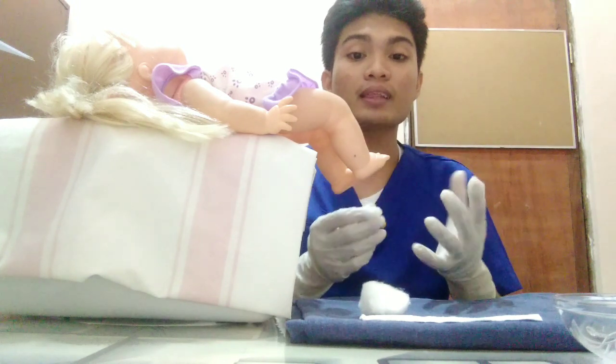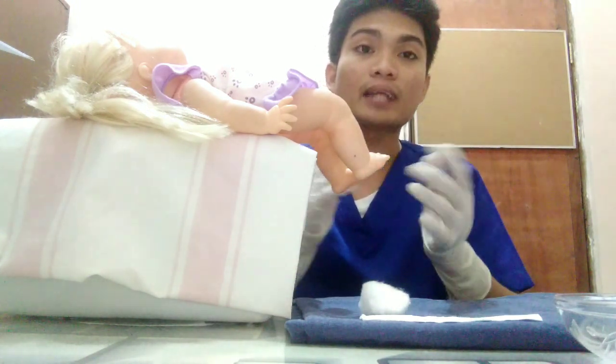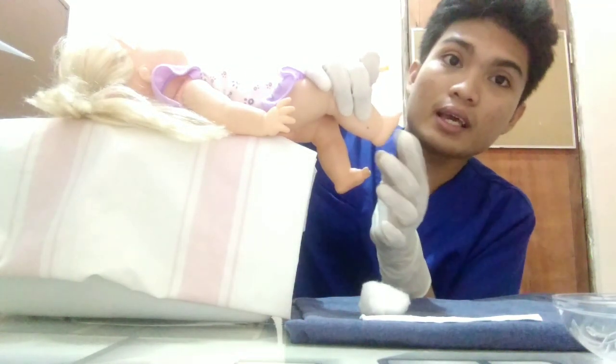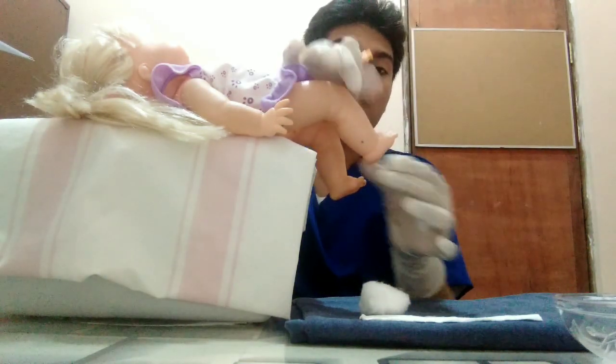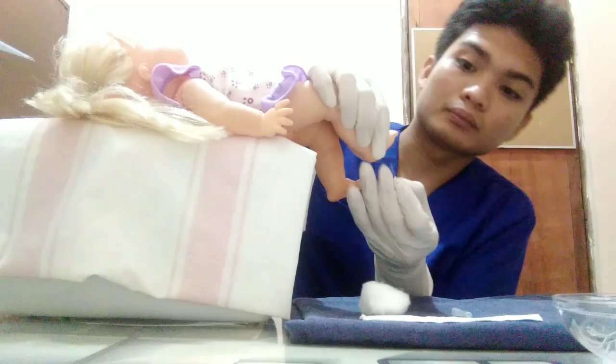So when we prick the heel of the baby, we should prick on the medial side or the lateral side of the heel. So that would be in this part, or in this part, okay? So now we will be pricking it.